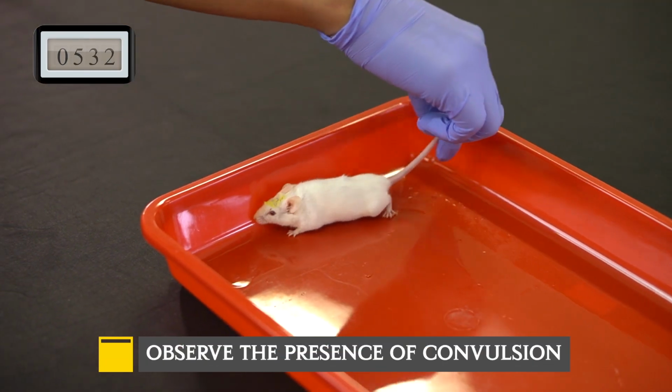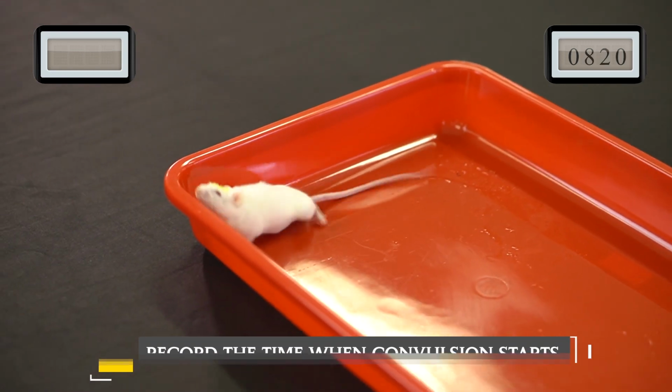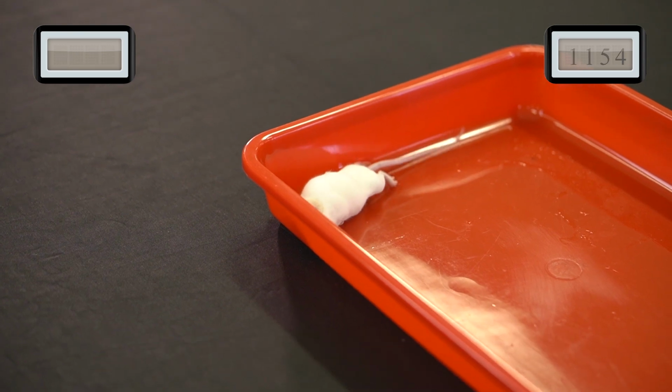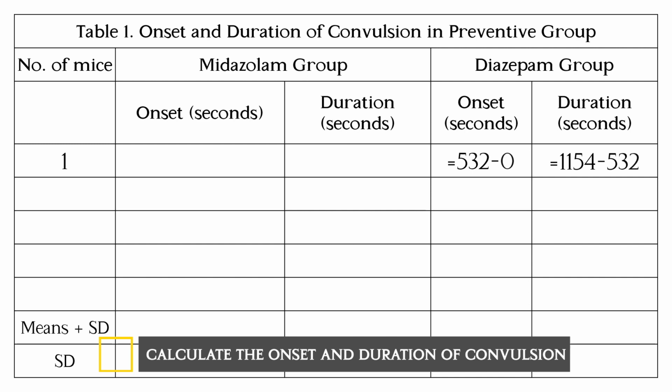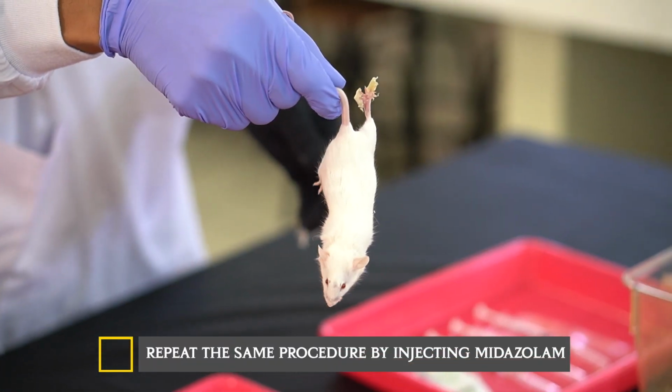Observe the presence of convulsion. Record the time when convulsion starts. Record the time when the convulsion stops. Calculate the onset and duration of convulsion occurred in diazepam group. Repeat the same procedure by injecting midazolam to another mouse.